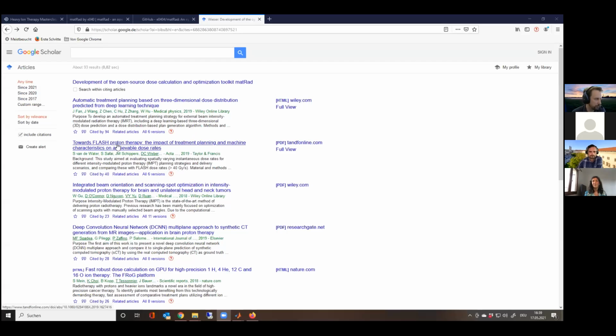You see, like Flash was already mentioned, there's a paper that used it for some things. So that's kind of the intention. I really want to stress this, it's not that you ask, can I do this aspect of therapy, this aspect. It's really just the basic functionality, and then you choose what to use, what to modify, and if possible, what to contribute.